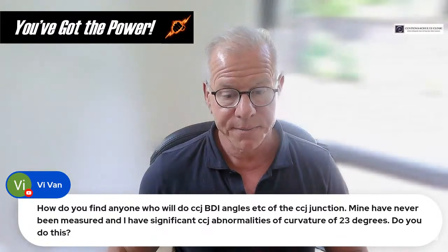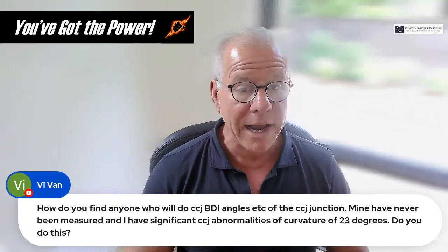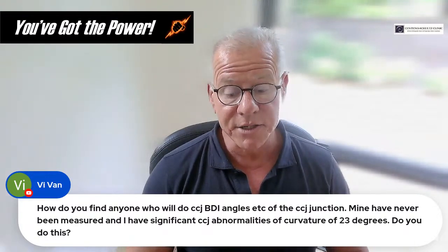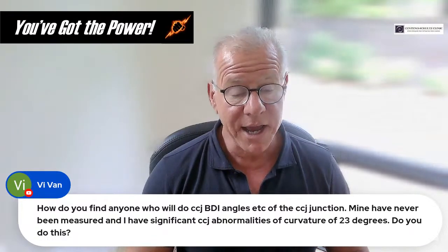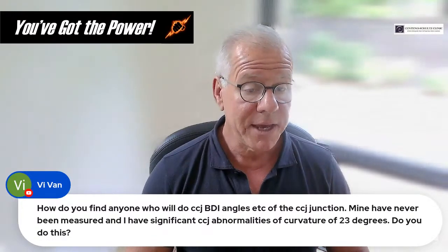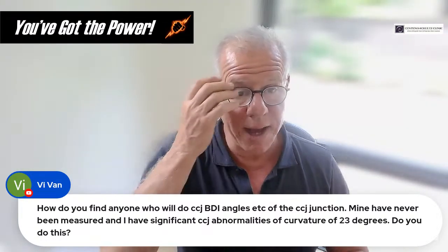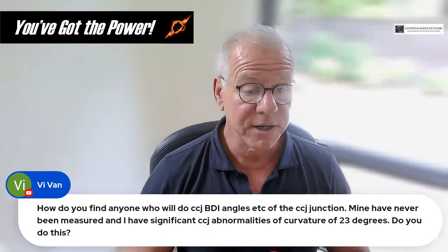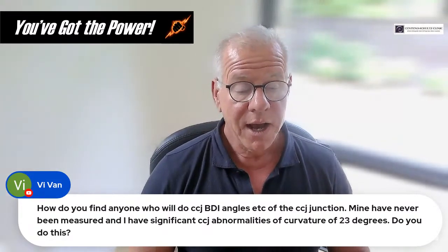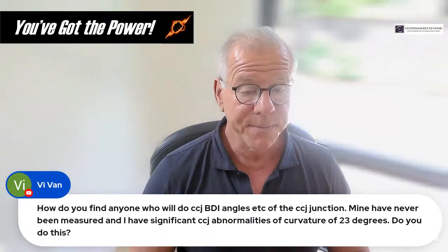Okay, guys, I think we're coming up on 1 hour. Any other questions I can answer? Just to sort of summarize what we talked about today. We talked about the whole concept of using ultrasound to measure the optic nerve sheath, and as such to determine whether or not there's intracranial hypertension.